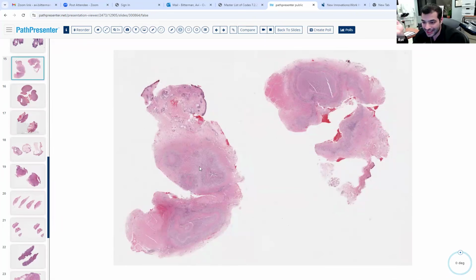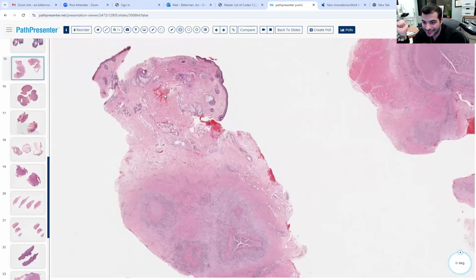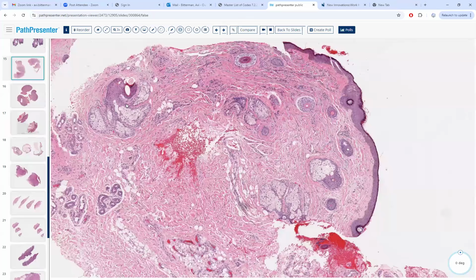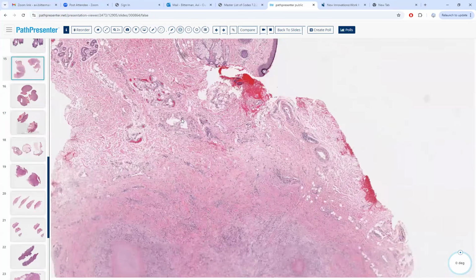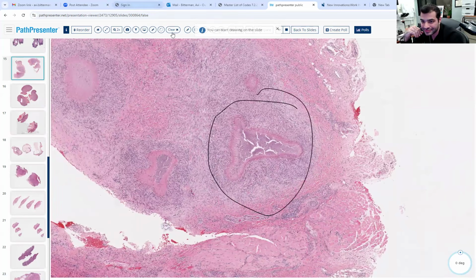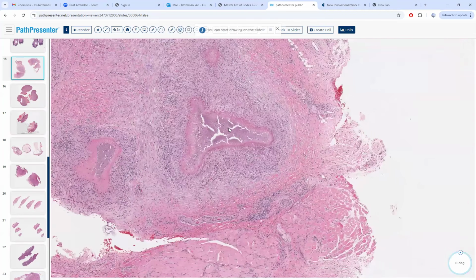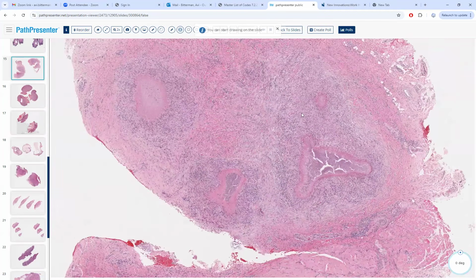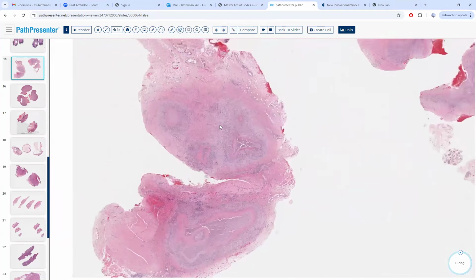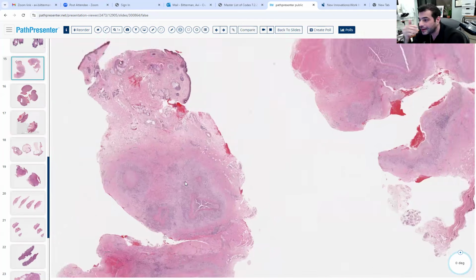Look at how large that was and compare that to this. First of all, with these structures, where might we be? Maybe on the face. Then look at this, and this. First of all, what kind of granuloma? Caseating, palisading. So what's your differential? LMDF or granulomatous rosacea.